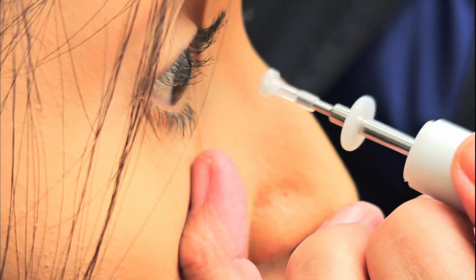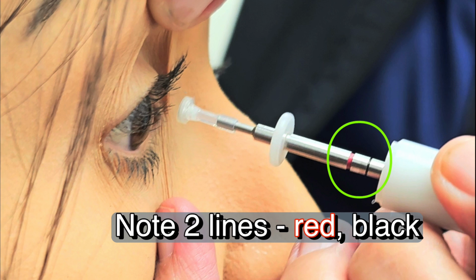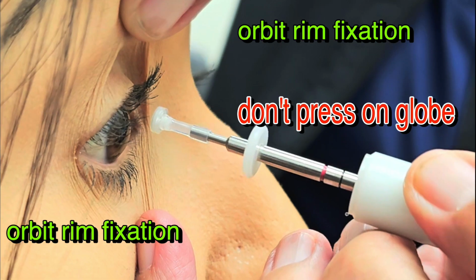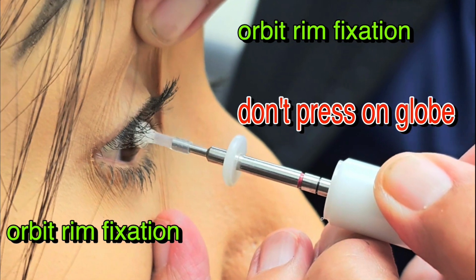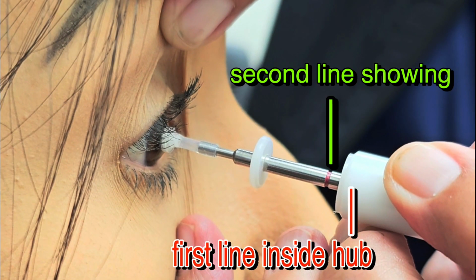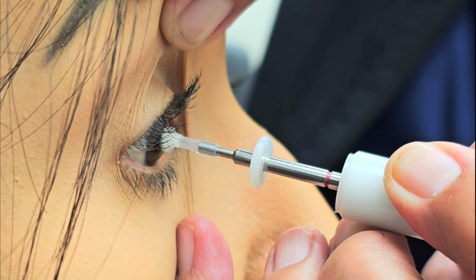And the most important thing is when you place the probe on the eye, you want to make sure the lids are out of the way, and we're going to press on the orbital rim. Fixate orbital rim, do not press on the globe. You'll notice the two lines there. Notice how the handpiece is pushed forward so that one line is buried, one line is showing.